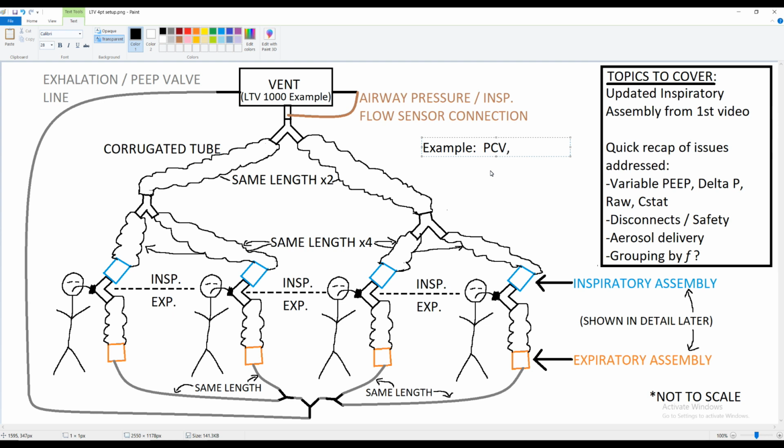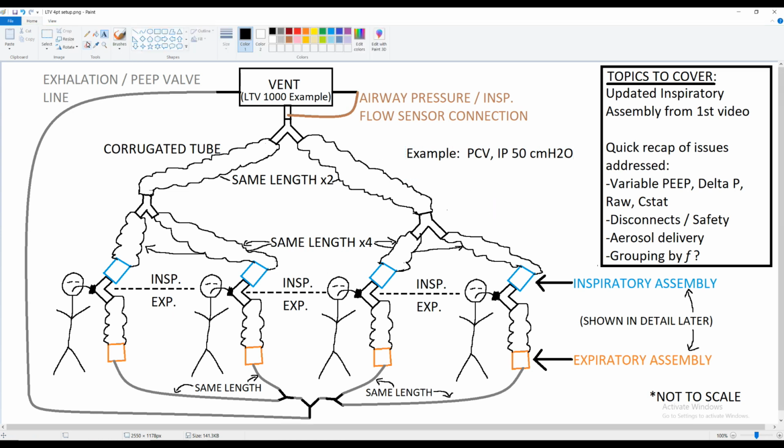Our patients would need to be paralyzed for this to work, heavily sedated, paralyzed, so there's no inspiratory efforts and they're not hogging air from any of the other patients or triggering the machine or anything like that. So it would essentially be control mode, whether you run that as control mode or AC. But I'm not going to get into that. It's pressure control ventilation, and let's use just a big inspiratory pressure. Let's say an inspiratory pressure of 50 centimeters of water pressure. So not all of our patients are going to need 50. We wouldn't want all our patients to get 50, but before we were stuck with all of our patients getting the same pressures, which was one of the huge drawbacks that I saw people complaining about. Well, here's what happens. We can do plus, let me make that a little thicker.